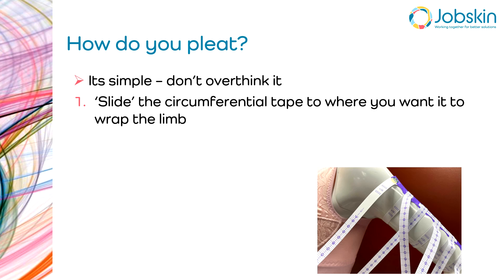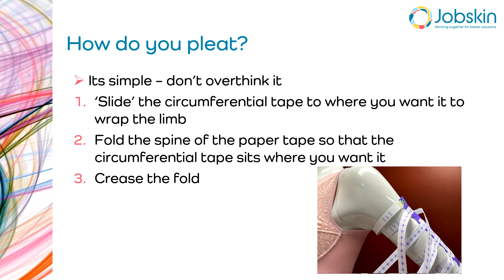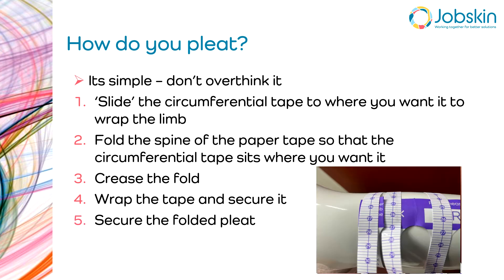How do you pleat? It's actually very simple — don't overthink it. You just slide the circumferential tape to where you want it to wrap the limb. Take that last tape that is unwrapped and slide it down the limb a bit so the spine of the tape will buckle. Then fold that buckling of the spine paper tape so that the circumferential tape sits just where you want it to sit. Crease that fold to secure it flat, then wrap the circumferential tape and secure it just as you would any other tape, then secure the folded pleat with a little bit of sticky tape.